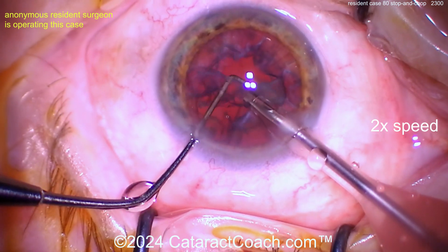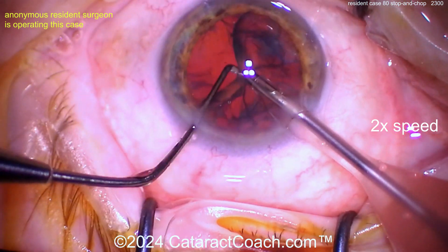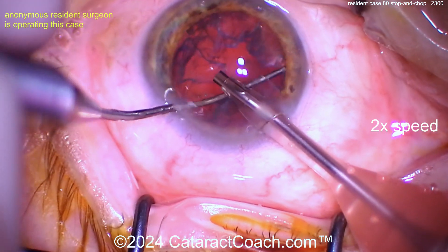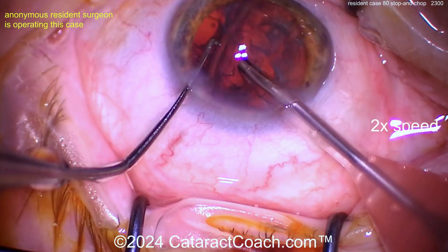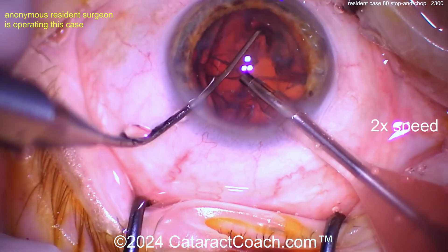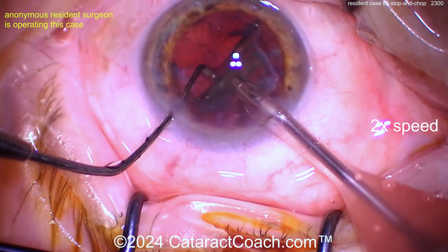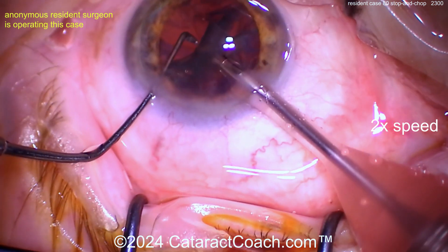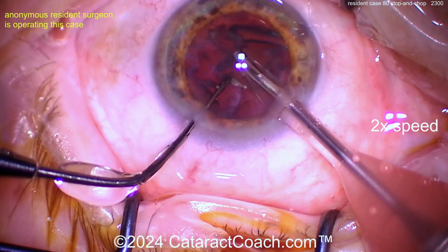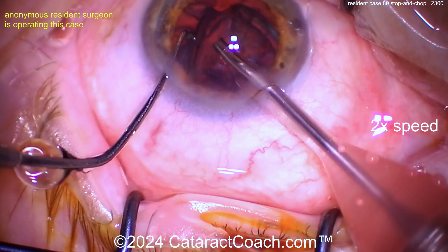Getting that last piece up — I like the chopper in the safe position, really well done. There's a bit of an epinuclear shell remaining. I try to get the epinuclear shell out with the phaco probe using vacuum only — no energy. See if you can bring the whole thing up out of the bag or flip it over. Flipping the epinuclear shell is usually the easy way. Chopper behind it — I like the two-handed technique, just tease it out of the bag. Once you get it flipped over it'll just become so easy. Vacuum only until it's loosened, then blip a little energy if needed to keep the piece moving.